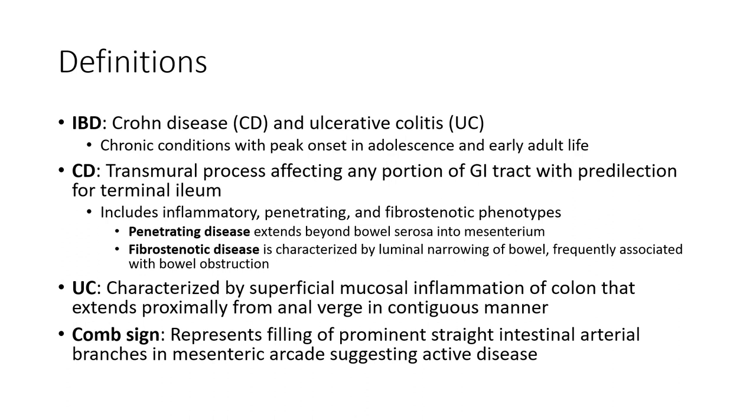Ulcerative colitis is characterized by superficial mucosal inflammation of the colon that extends proximally from the anal verge in a continuous manner. The comb sign represents the prominent straight vessels branching in the mesenteric fat, suggesting active disease.